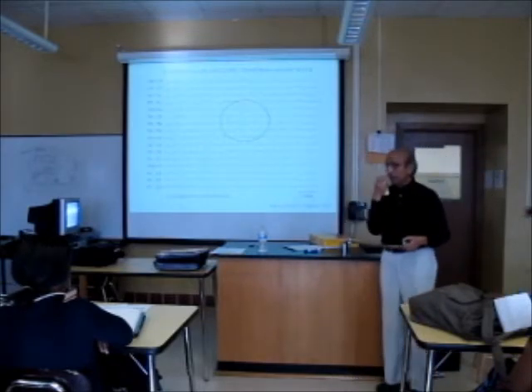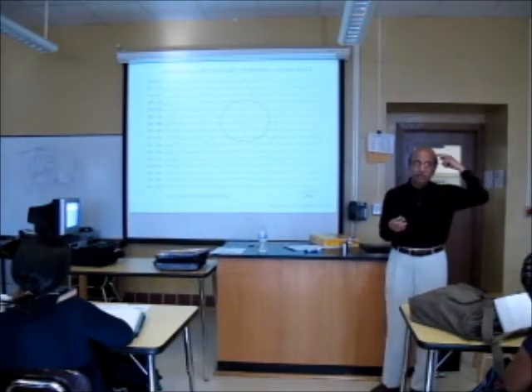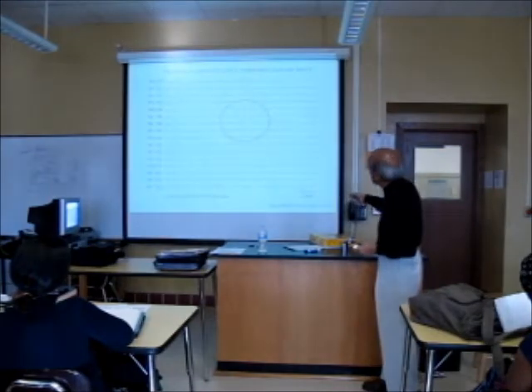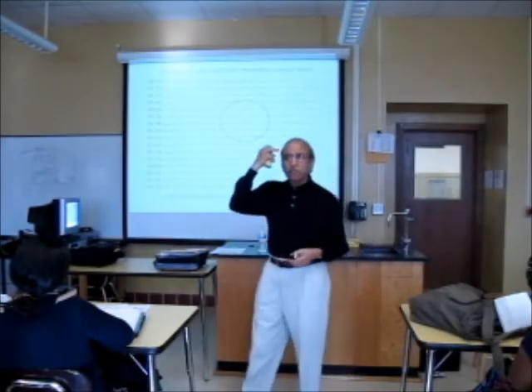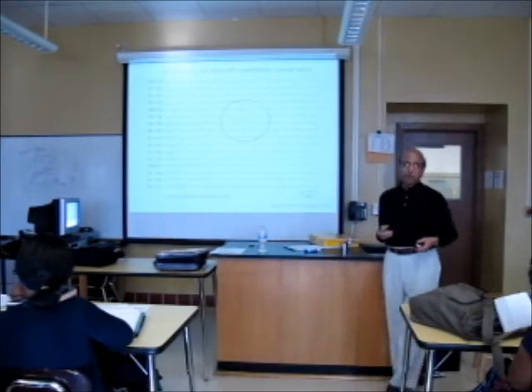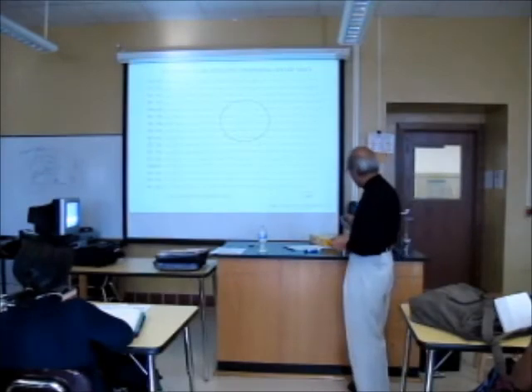Now, in complex partial seizures, the seizure activity usually originates from one of the temporal or the frontal lobes. And here we can see a spike coming. We are recording a spike from the F8 area, which represents my right anterior temporal region. It's a very, very common site. About 25% of all epileptic patients have what we call complex partial epilepsy. Okay?